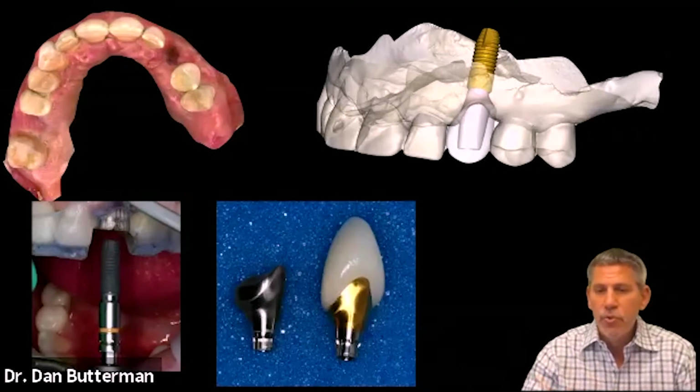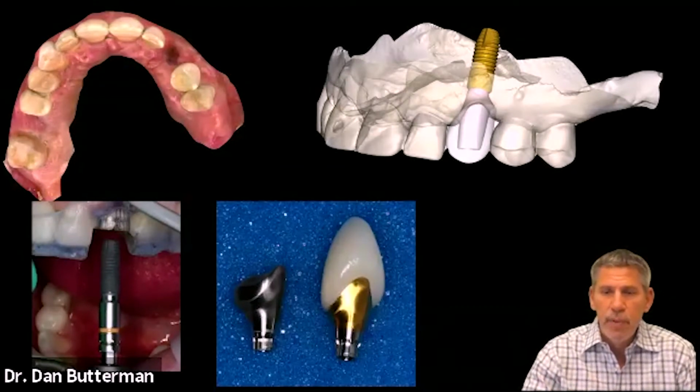So again, I've got these two things in the box. I've got a custom healing abutment, and then I have a final abutment with a temporary crown.